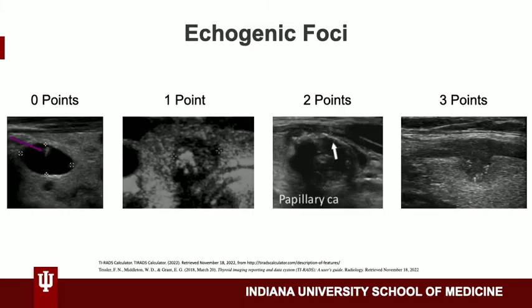Finally, we will examine the nodule for echogenic foci. If there are no echogenic foci, or echogenic foci with comet tails, it gets zero points. If there are macro calcifications it gets one point. If there are peripheral calcifications it gets two points. If there are punctate echogenic foci it gets three points.